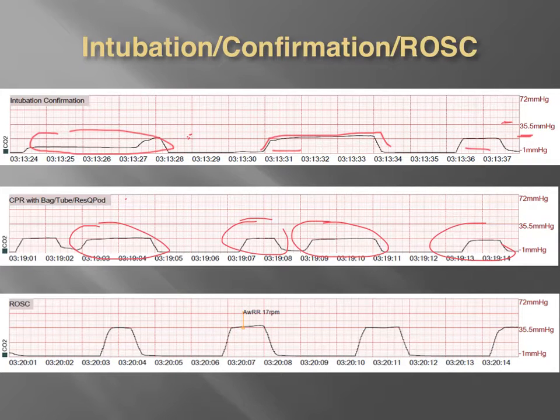And remember, capnography comes back to ventilation, perfusion, metabolism. Well, if we're adequately controlling ventilations to where we know we can control rate and tidal volume very precisely, and then we're also, say in this case, doing really great CPR, but we have a really low end tidal level, then that might tell us that there's some kind of additional perfusion or metabolic issue going on as well.